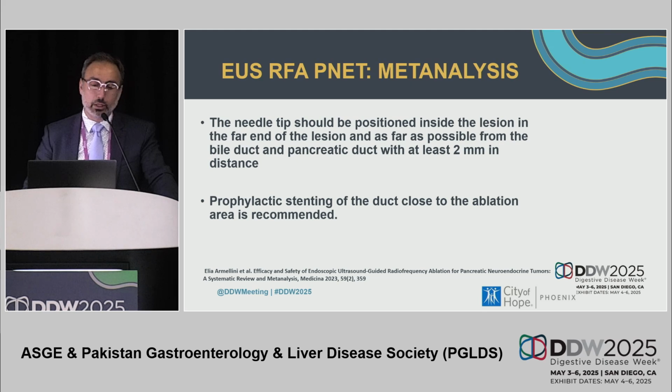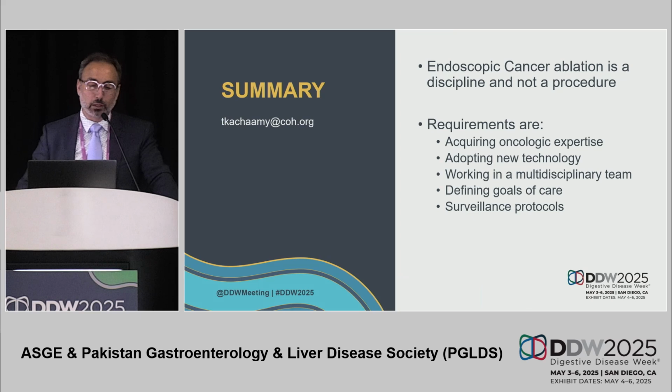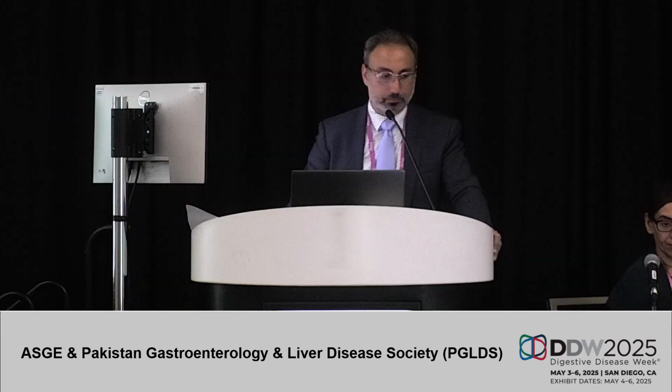Typically, what we do is put the needle in the tumor and then we ablate. This is an adjustable modality until the hyperechoic changes get to the edge of the tumor, and then we move the needle until the entire tissue becomes hyperechoic. So in summary, endoscopic cancer ablation is a discipline and not a procedure. The requirements are acquiring oncologic expertise, adopting new technology, working in a multidisciplinary team, defining the goals of care, and having rigorous surveillance protocols. Thank you very much.